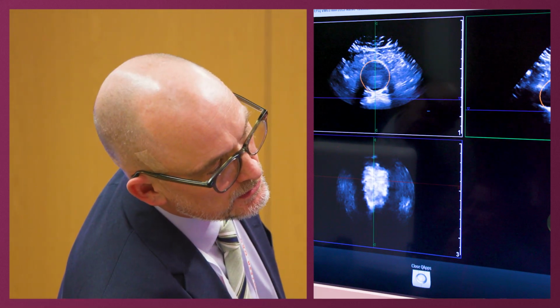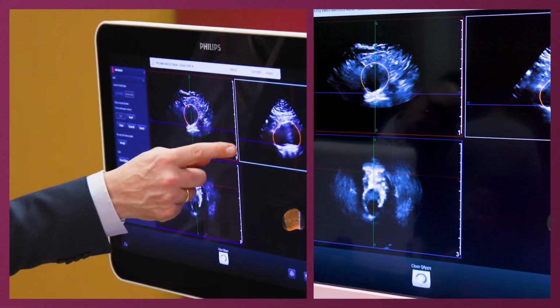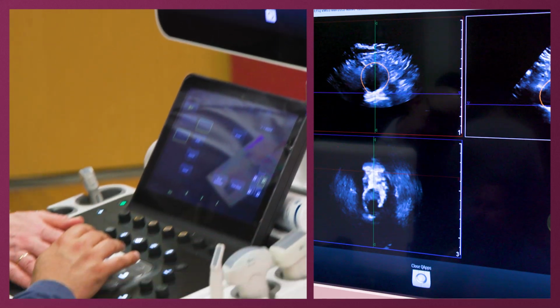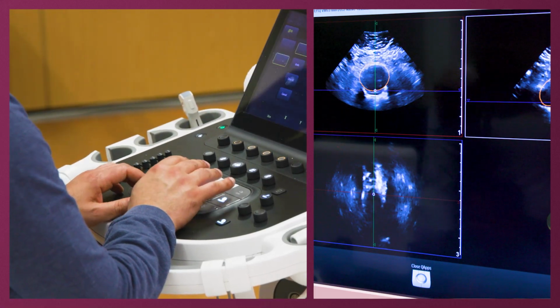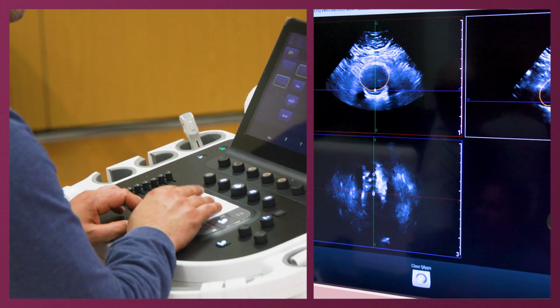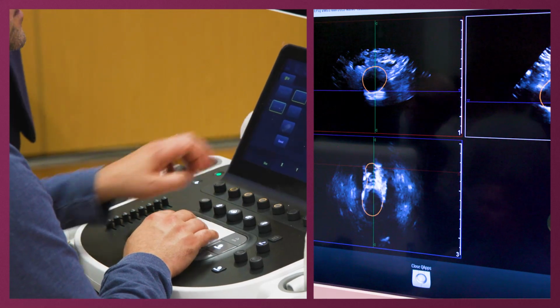But let's say I want to edit the width. I think you just make dots. Maybe on the right. So you just use this button. So you do, for instance, I think it should be here. You could say. Oh. You see? Beautiful. Okay. So yeah, I messed it up. And I think there's a clear all button if it goes berserk, and then you can start over.